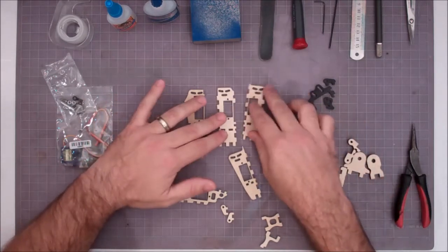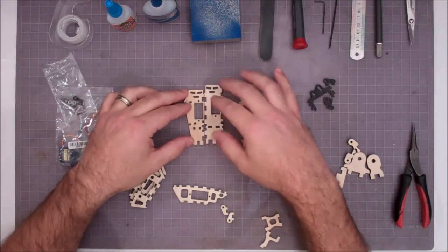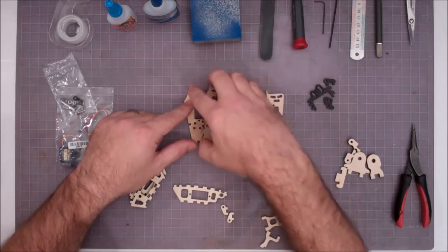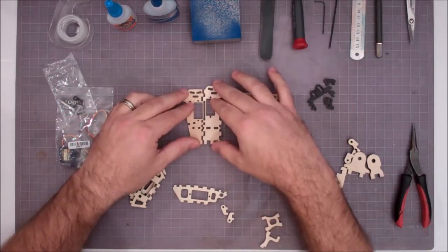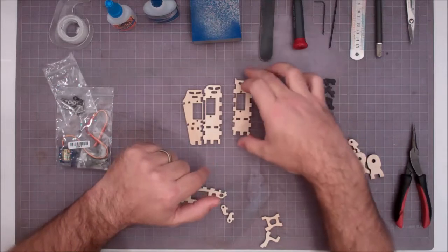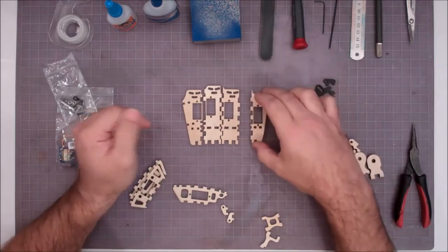If you look at them, obviously the slots go to the top. You can just take the plates and lay them up against each other, and you'll see this upper line here will be a nice clean line. So I can tell that this plate, if I push it, oh, there it goes. If you flip them around and find the plate that lines up, that's the one you're looking for. So you got this one. Next, obviously, is this plate. And if you lay it over there, you'll see that it continues the line up top. And then finally is the pinky plate.